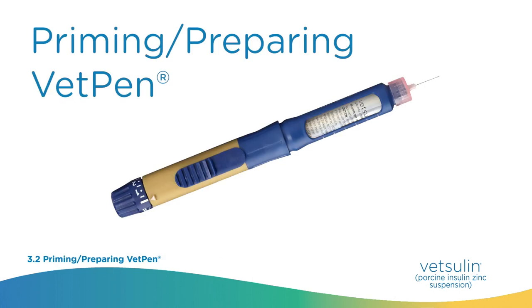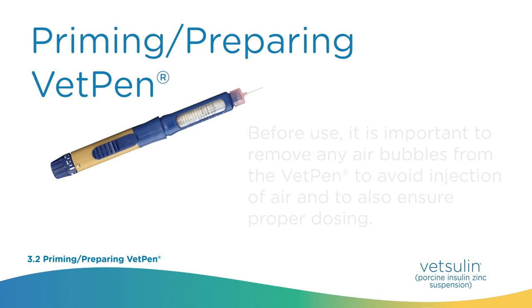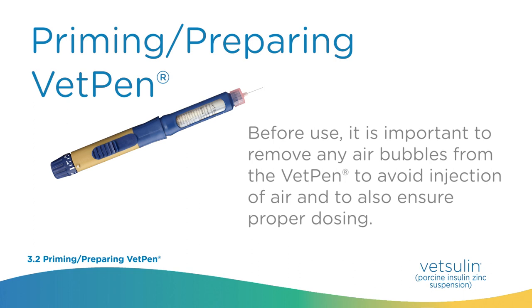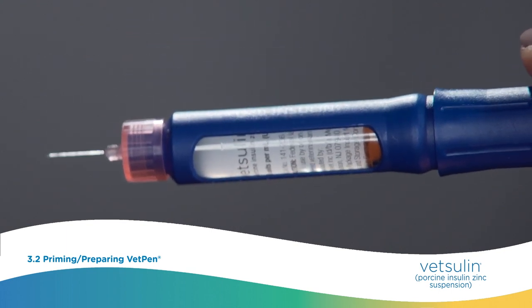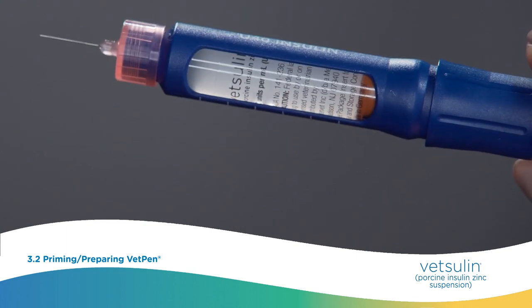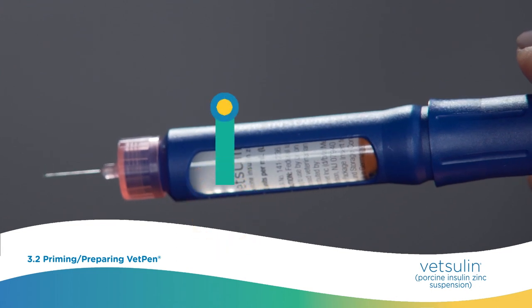Priming and preparing VetPen. Shake the cartridge in the VetPen until a uniformly milky suspension is obtained. Before use, it is important to remove any air bubbles from the VetPen to avoid injection of air and to ensure proper dosing — this process is also referred to as priming. Please note, the Vetsulin 2.7-milliliter cartridge contains small glass beads that aid the insulin mixing process. These are not air bubbles that can be tapped out.